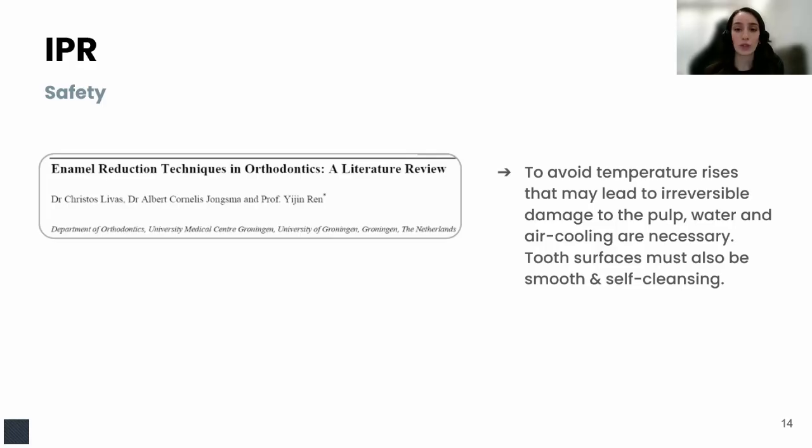And one of the safety precautions that clinicians are recommended to follow is to always make sure that they have some sort of air and water cooling. This is basically just to avoid any temperature rises, because sometimes this may lead to irreversible damage to the pulp or irritation to the patient. So it's just important to make sure that you are using the water syringe and maybe some air cooling while performing the IPR, just to avoid any discomfort to your patients.